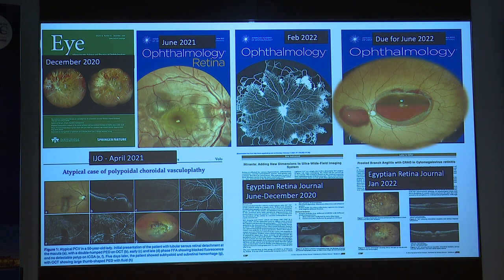And besides that, many people ask me questions about what would be the cost of it. This is the cost which you pay. In the last 18-20 months, these are the three cover pages of ophthalmology for us. This is Eye. We have 2 Eye cover pages, and these are our publications. Thank you.